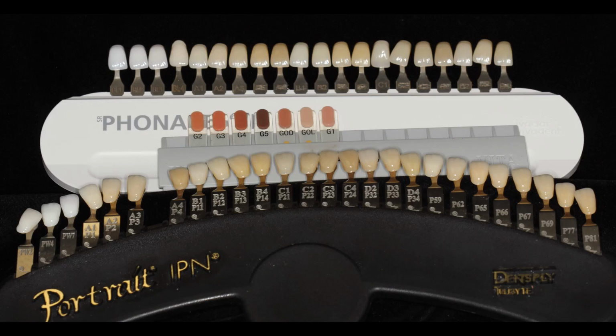When I tell you we've got a lot of different shades to consider, I'm not kidding. These are the shade guides that we have to pick from. And we always get excited when patients want to do something that looks realistic. So for a 70-year-old man with a complexion like this gentleman, his opinion and his family's opinion was that he wanted the teeth to be age appropriate. So we're ruling these out completely. I mean, this is just not what he wanted.